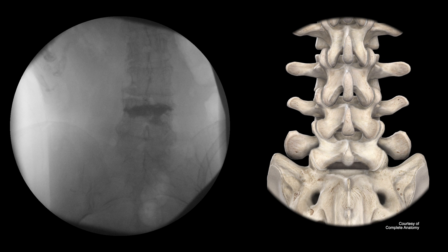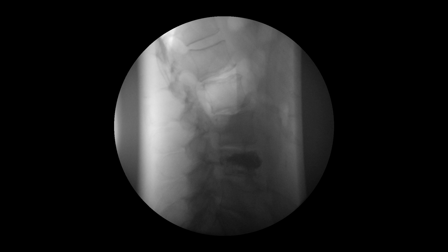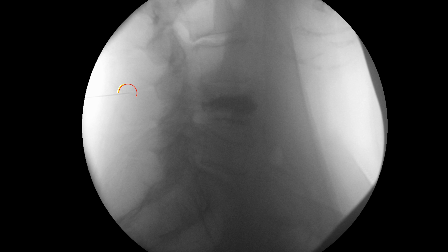First, the anterior-posterior fluoroscopic view is used to identify the correct level to be treated. The lateral view can be used for additional confirmation. A spinal needle is inserted first to map a trajectory at the appropriate surgical level.